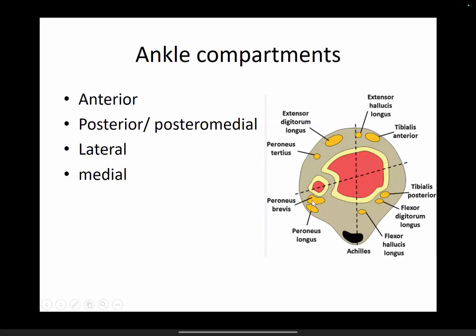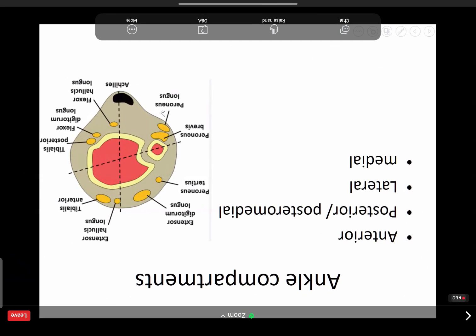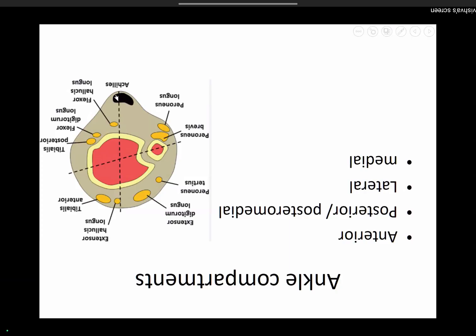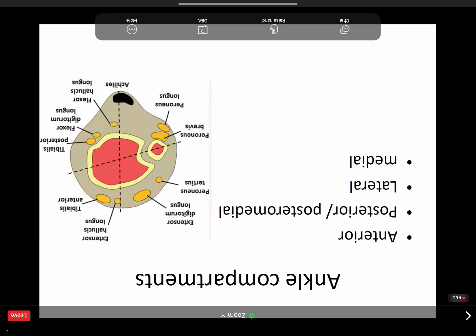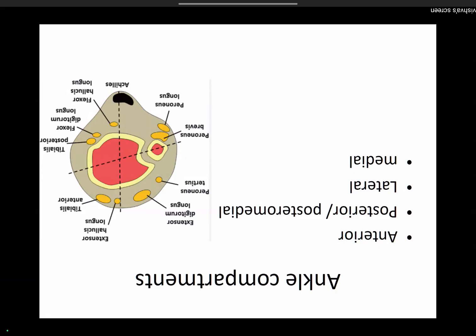In the posterolateral compartment we have peroneus brevis — 'B for B,' very close to the bone — and peroneus longus. They usually share a common synovial sheath, though variable anatomy exists. Then comes the biggest tendon of the body: the tendo Achilles, which inserts over your calcaneum. It does not have a tendon sheath — it has a peritenon. So there is never tenosynovitis of the tendo Achilles; it is always peritendinitis.